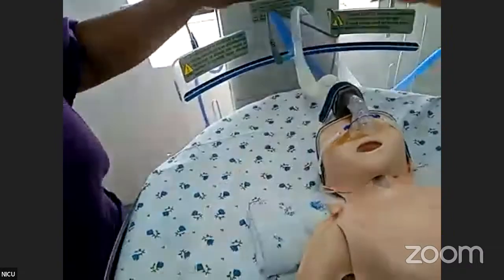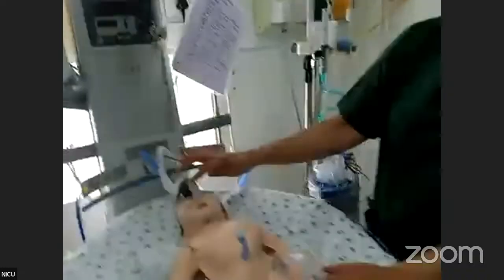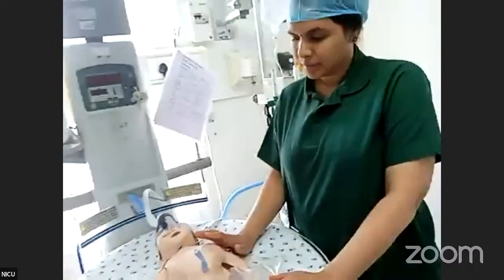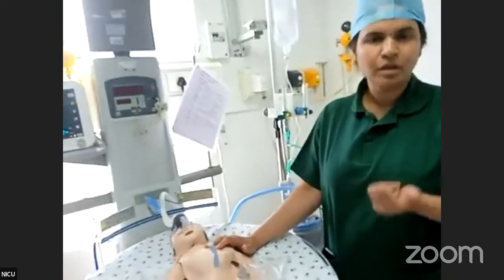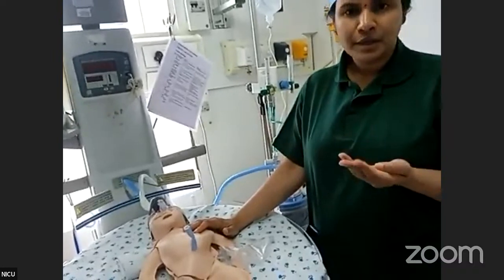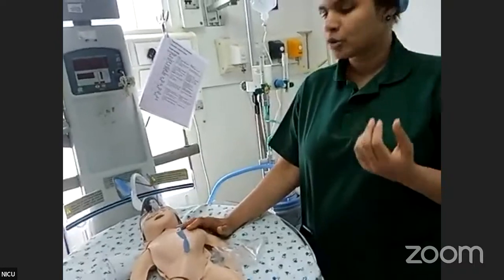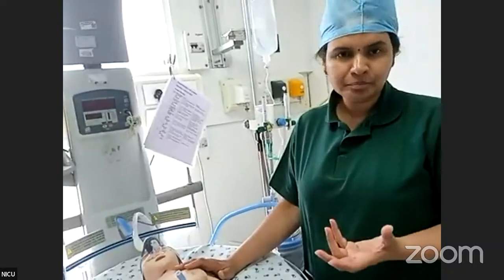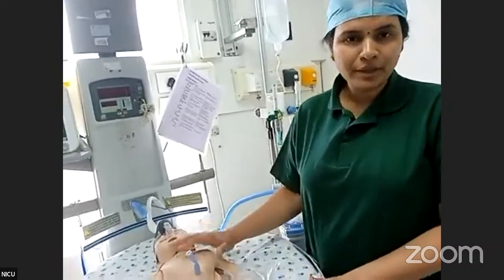So now while monitoring the infant on CPAP, the monitoring aspects include some aspects in the baby, some aspects in the interface, and some aspects in the circuit. So what are we monitoring? Monitoring the baby, the baby's hemodynamic status as monitored by the heart rate, CRT, pulse volume, blood pressure, urine output, respiratory rate, Silverman score, saturations, air entry, sensorium, abdomen girth, whether the abdomen is soft, whether the OG tube is left open 20 to 30 minutes after the feeding is finished, presence or absence of seizures, color, comfort, all these aspects are to be monitored continuously.